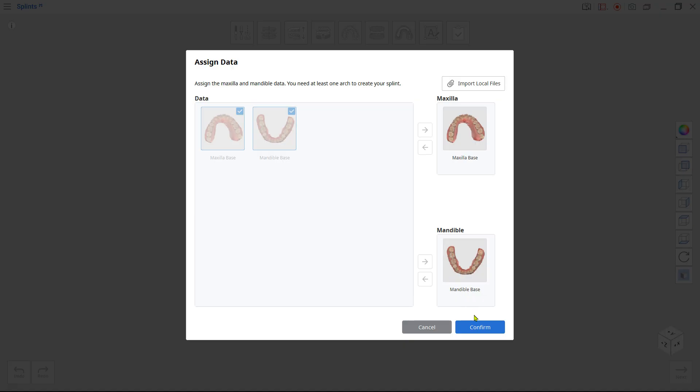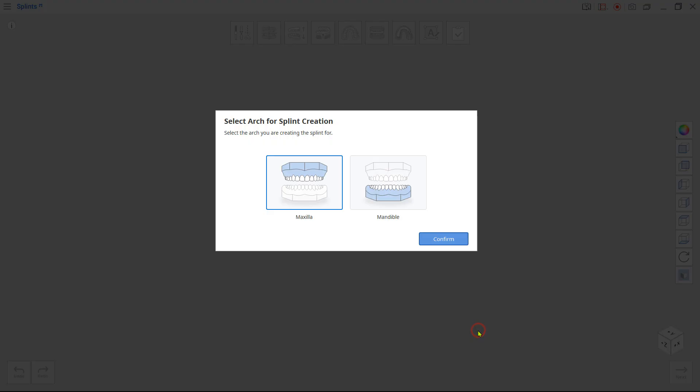The program will automatically assign your data. In the next window, select which arch is for your splint.